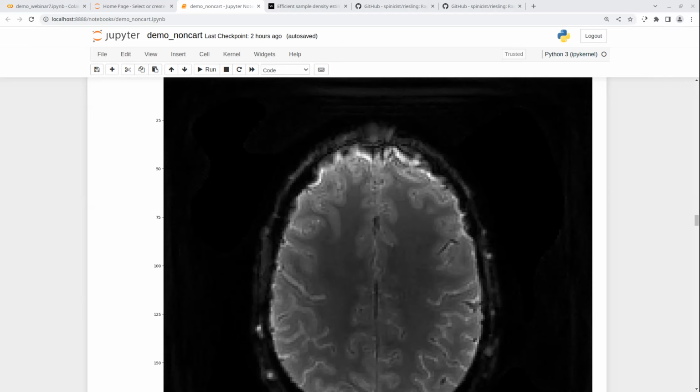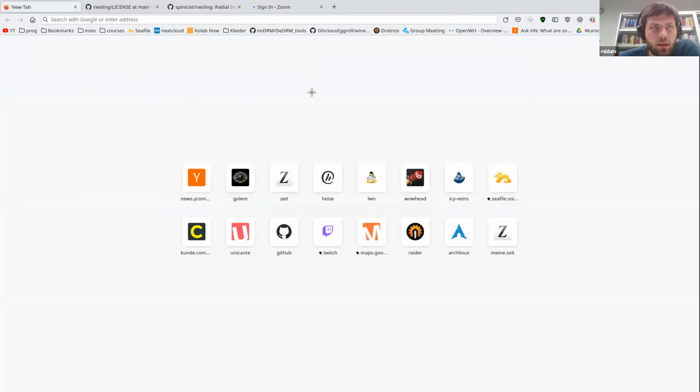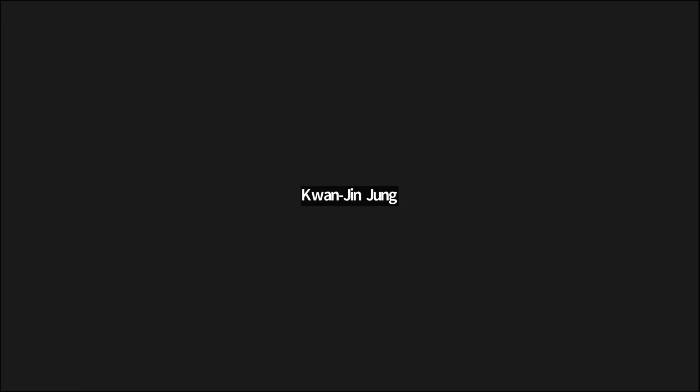I have a slightly different question. I tried BART 8, and the same NUFFT fails on BART 8. When I switch back to BART 7, it works again. So what is that? Okay, BART 8, the release? Do you get an error, or just a command error? I didn't really check too much because I switched back to 7 hastily. Yeah, it worked.